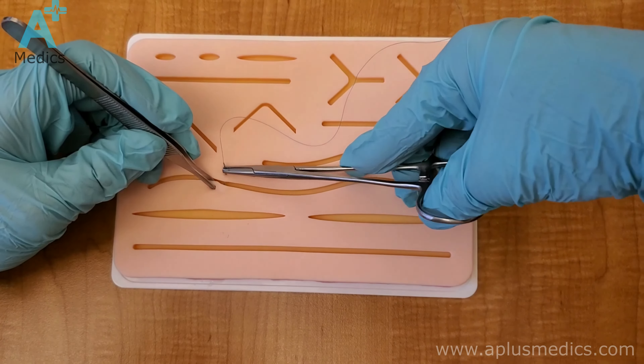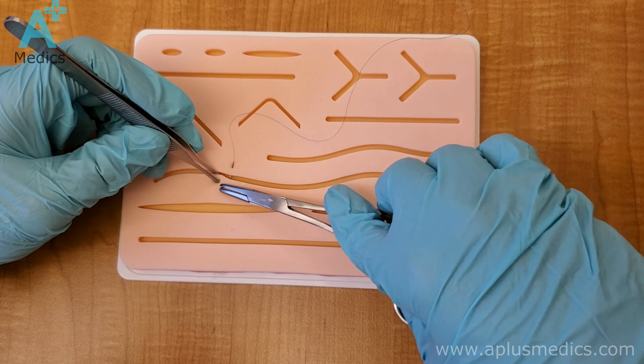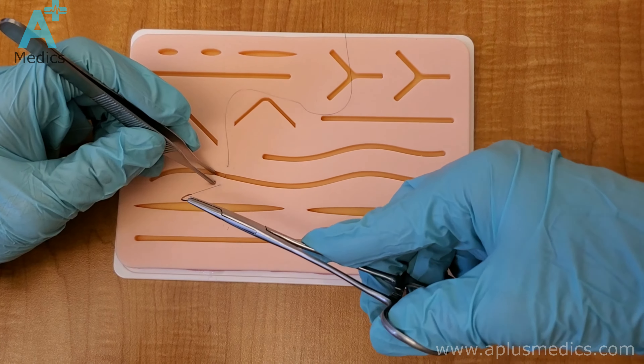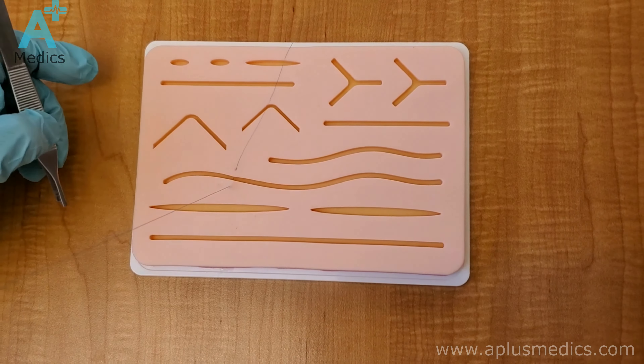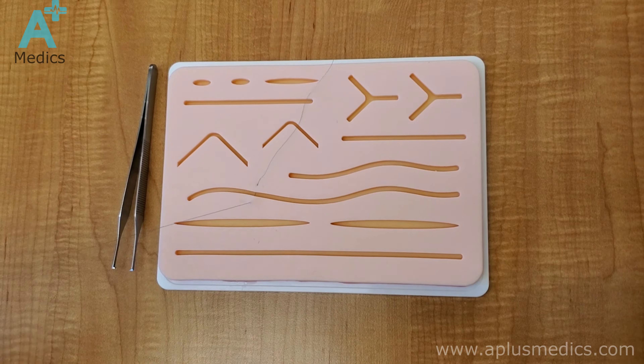First, start by driving the needle in — try to go perpendicular to the skin and then take a nice smooth bite towards the other side. Pull the needle out and then pull the string all the way until you have a short side and a long side.